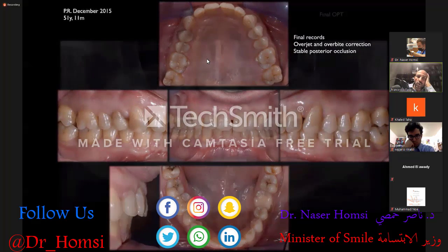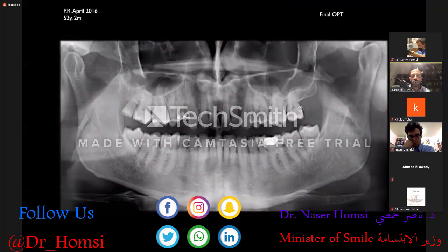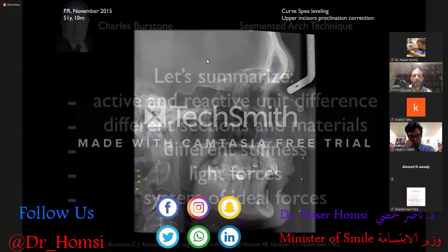I would like to show you the final OPT of the patient and the final lateral cephalometric with the good leveling of the lower curve of Spee and the correction of the flaring of the upper incisors.